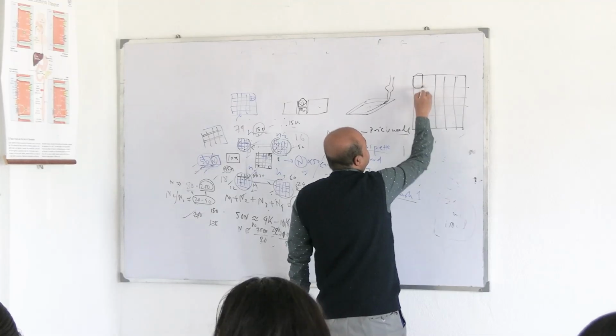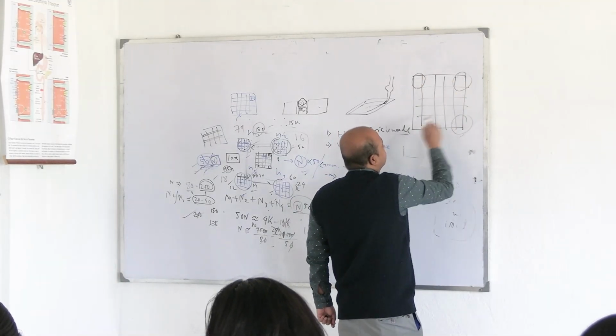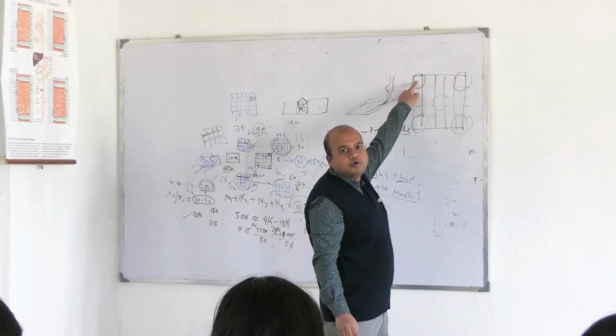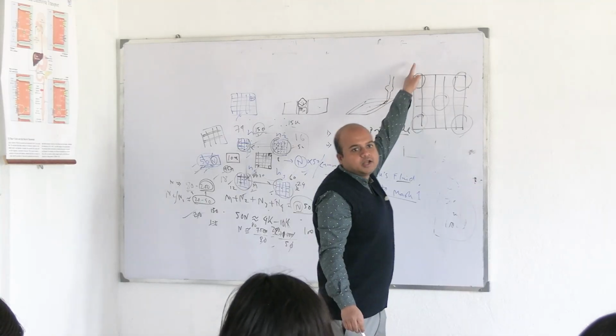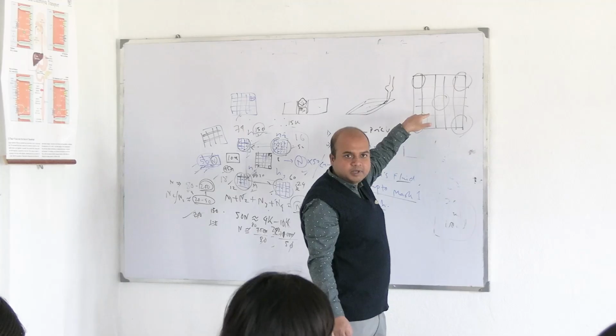This 25 equal squares counting is done in the corner 4 and the central one. How to identify the corner 4? On the left upper, there will be triple lines on the left and upper sides, and on the other 2 sides there will be similar RBC squares.